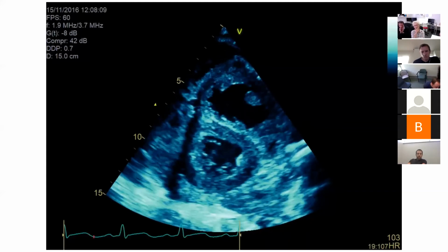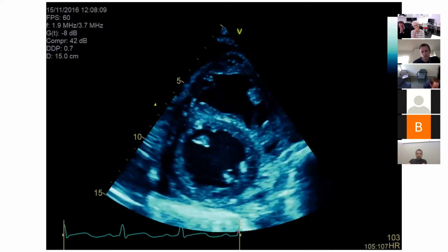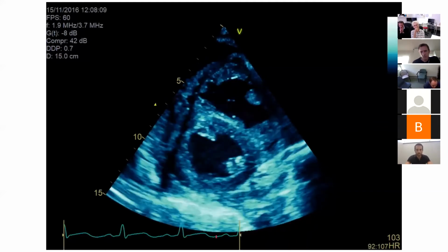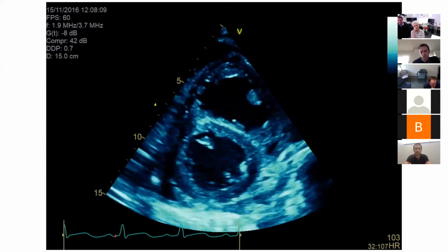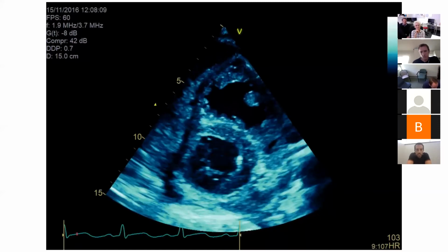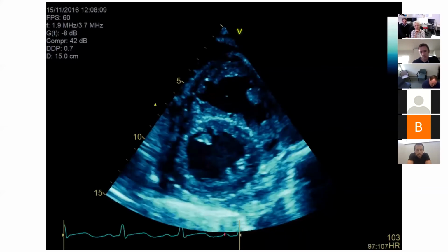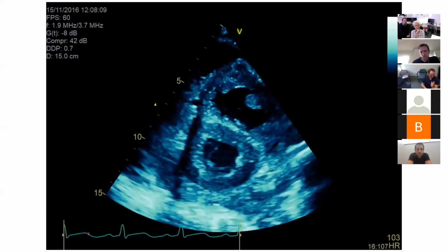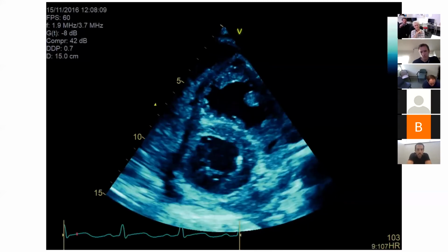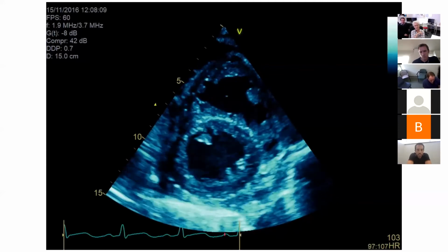Give me a bit more on that septal flattening. You're absolutely right. I think it does look like it's worse during systole. Anything else? But it's still present during diastole. The right ventricle is enlarged. What about the first cardiac cycle versus the third? It looks worse during the first cardiac cycle, but that might have something to do with the angle shifting a little bit during respiratory variation. Brilliant, nice. So you're getting the change in that septal bounce with respiratory variation as well.